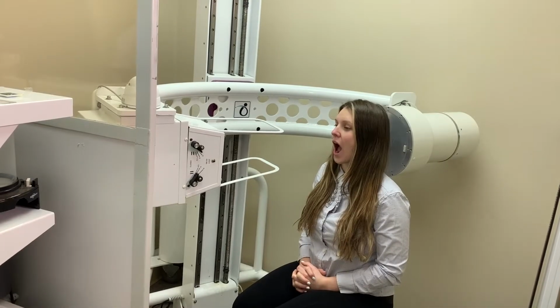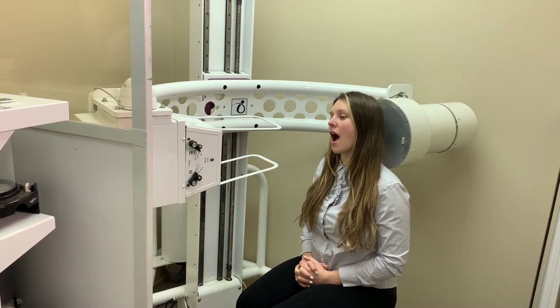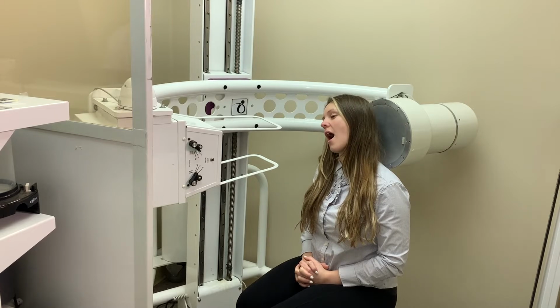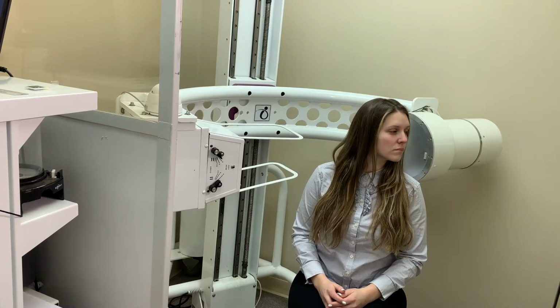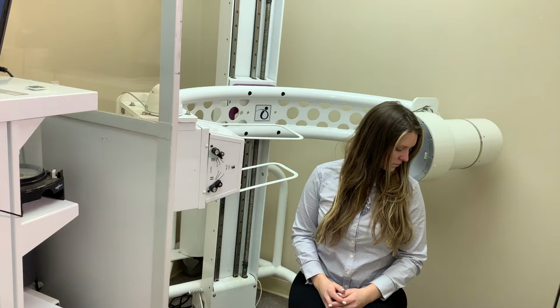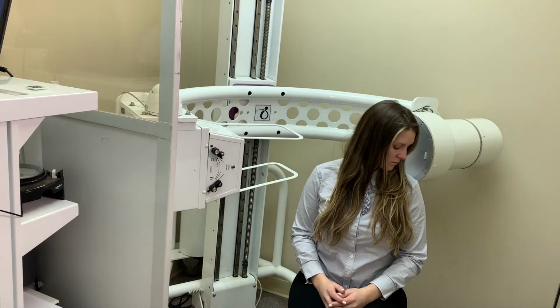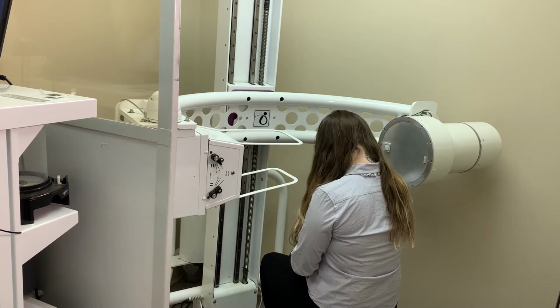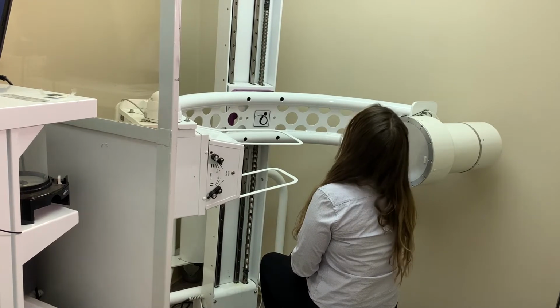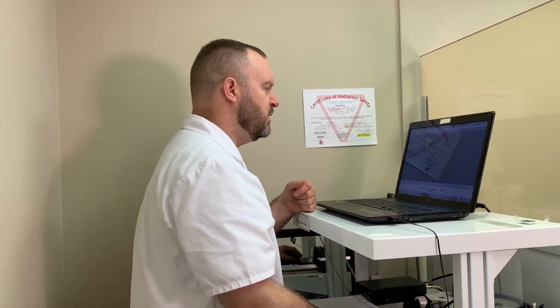Alright, so go ahead and tilt your head to the left as far as you can. Perfect. To the right as far as you can. And back to the left as far as you can. Chin down just a touch. There you go. Go ahead and turn your head to the left. Down as far as you can. Good. And back as far as you can. Good. And down as far as you can. So go ahead and bend your head down as far as you can, a little bit faster yet. Good. And back as far as you can. Excellent. Do forward one more time. That's it, we're done. I'll save that one and then I'll show them to you.